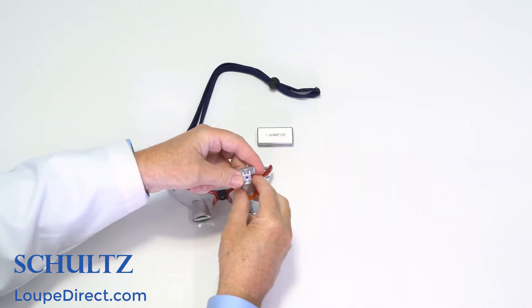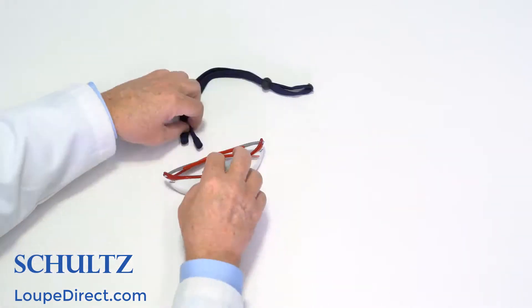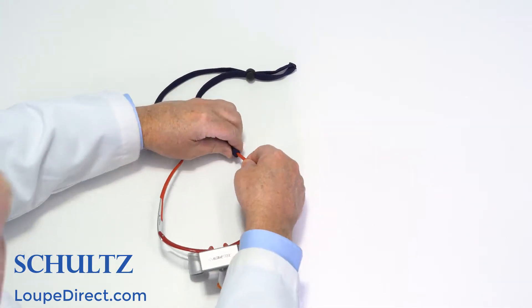To attach the headlight, simply slide them onto the glasses as demonstrated here, then snap on the battery, and attaching the head strap is easy as well.